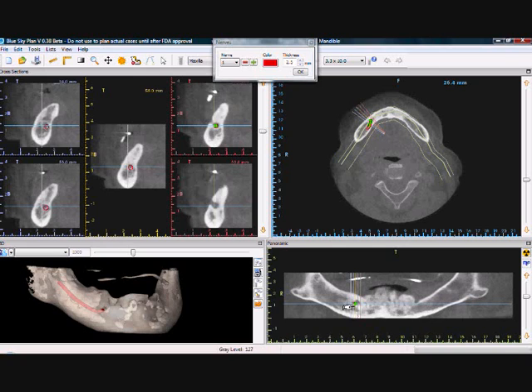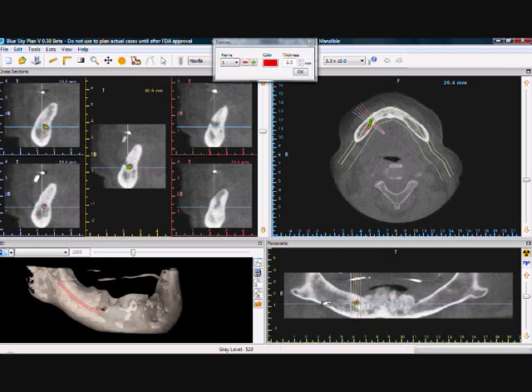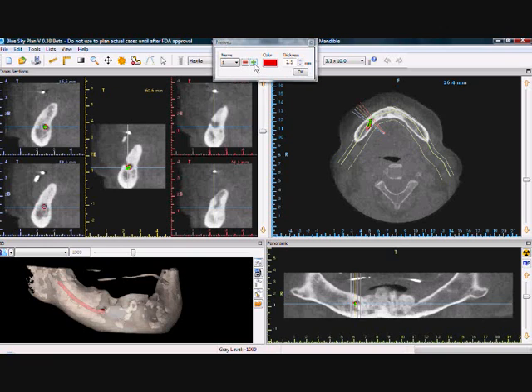We can view the nerve that we are drawing in 3D. We are able to start drawing a second nerve by clicking on the green plus sign, indicating to the software that we'll be drawing a second nerve and not continuing the first nerve.